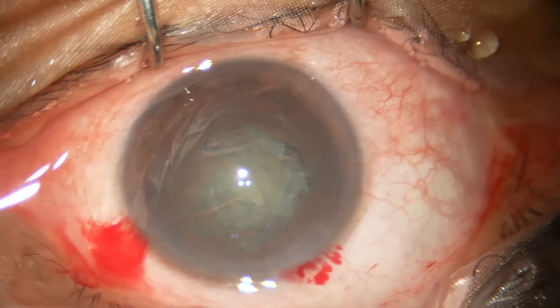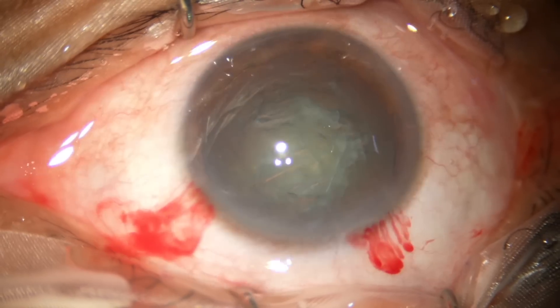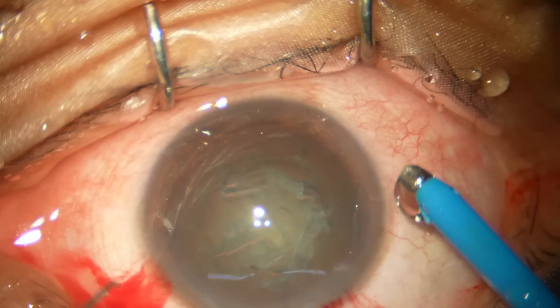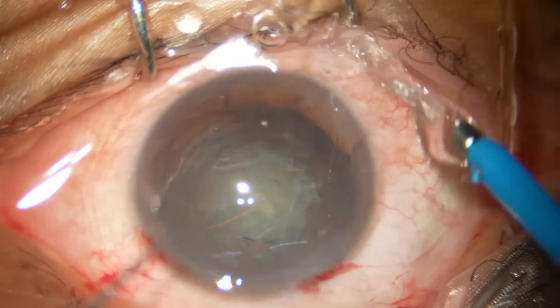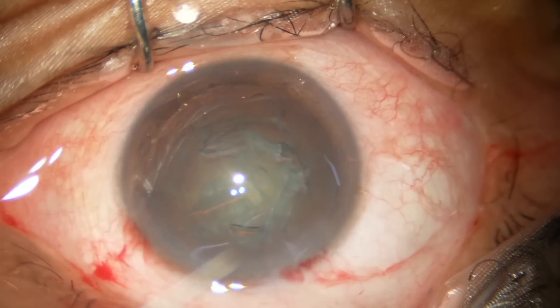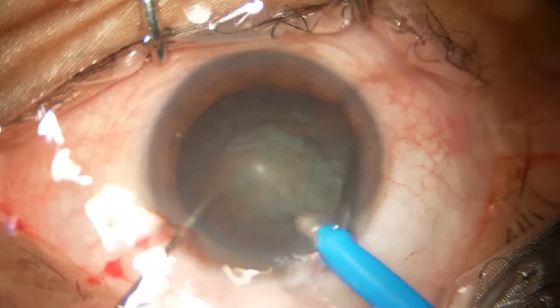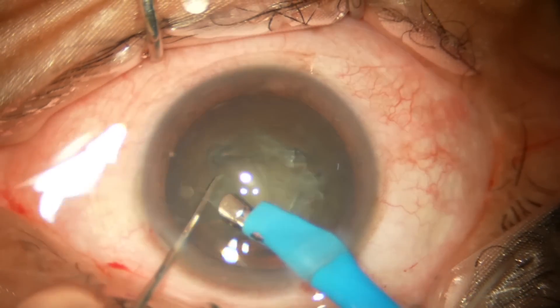We will emulsify each nuclear half. At this time the settings are: vacuum is 90 mmHg, aspiration flow rate is 25, and power is 60 percent.